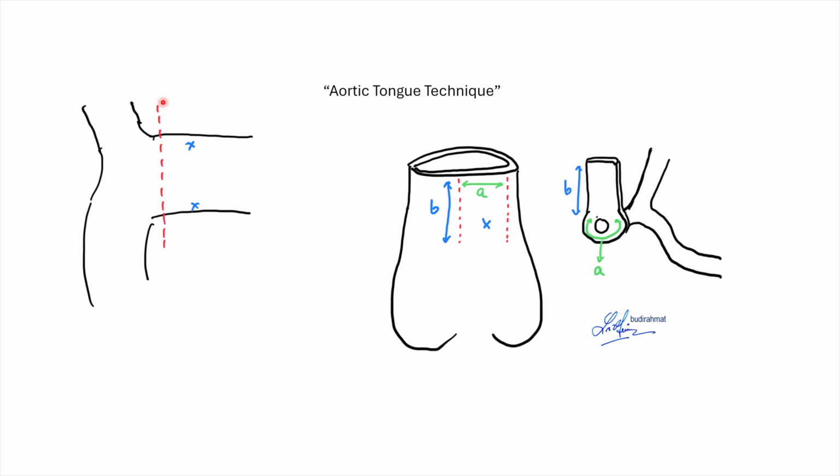And if you want to cut the main pulmonary artery, please cut it as high as possible, close to the bifurcation. So in the cross clamp, please harvest the coronary artery button as wide as possible, close to the aortic flap, and also with the wall here big enough, from the previous aortic wall.